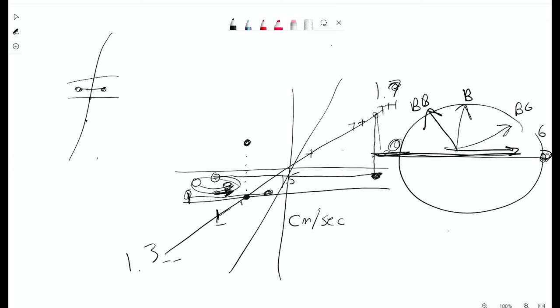A lot of RADs will tell you that you really can't visualize the vessel wall nearly as well on CT, because of resolution. Partial voluming. Oh, yeah, so think about if I'm looking straight down, top down.